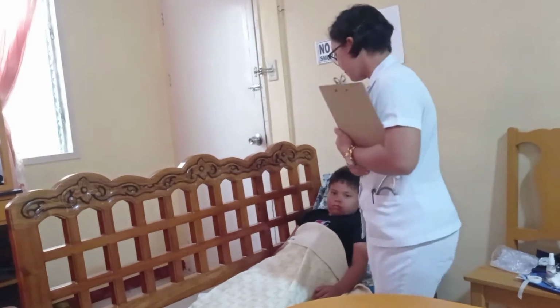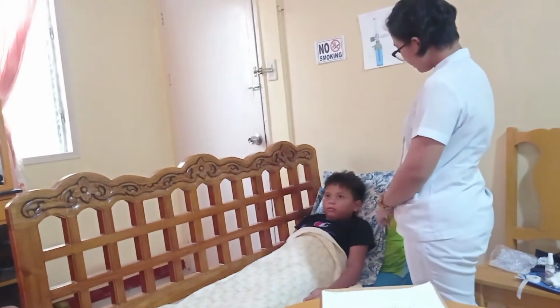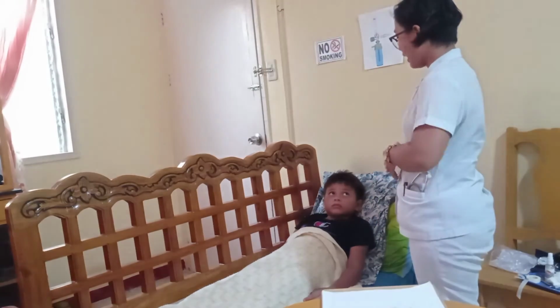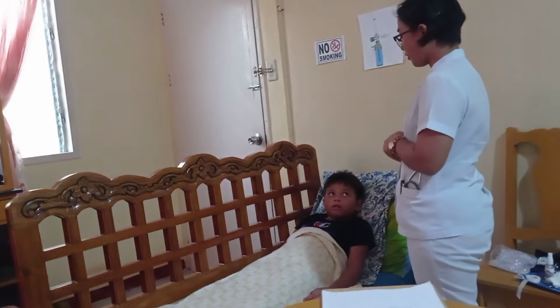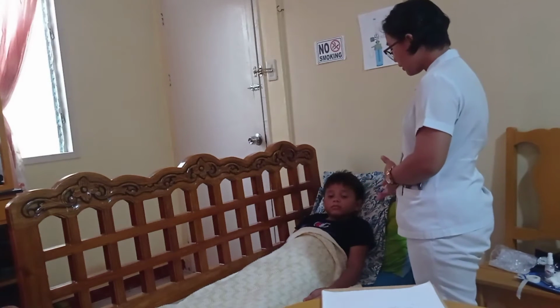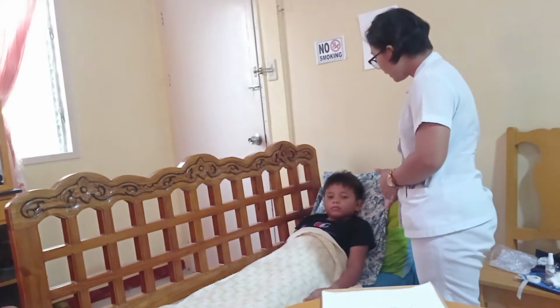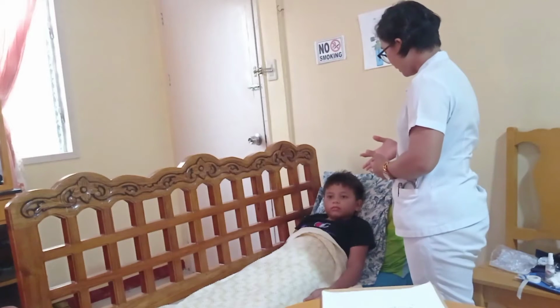Then, prior to performing the procedure, I am going to introduce myself and verify my client's identity using the agency protocol. Good day, sir. I am student nurse Esther Baguio and I am going to administer an oxygen therapy. But before that, I am going to verify your identity. I would like to ask, what is your name and when is your birthday?